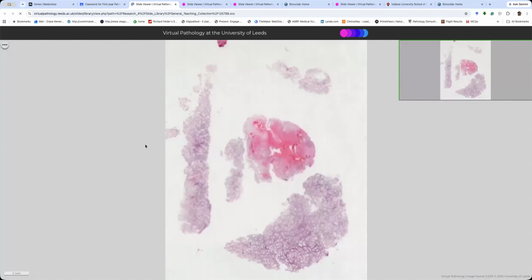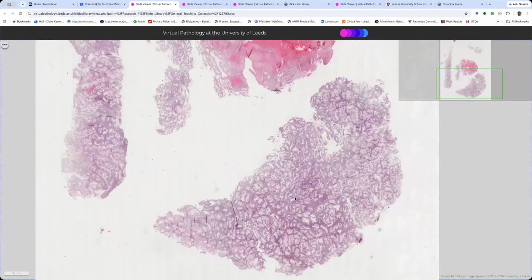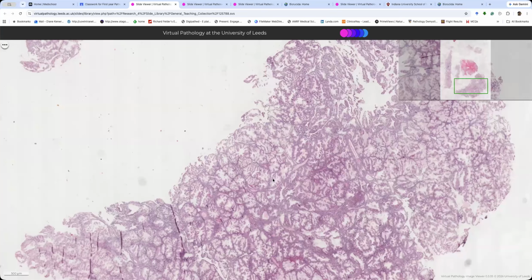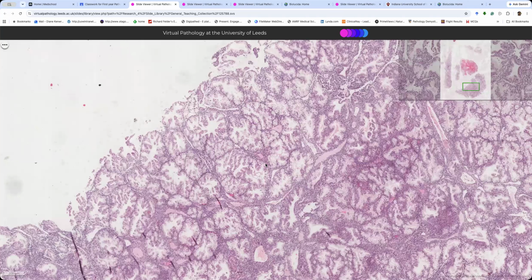Here we go. Next one. Whoa, look at this. All right, so a cancer scan. You might look at this and think it's cancer. I have had cases sent to me on referral asking about this funny kind of cancer. Is this clear cell carcinoma of the endometrium? No, big pitfall. This is not clear cell carcinoma of the endometrium.